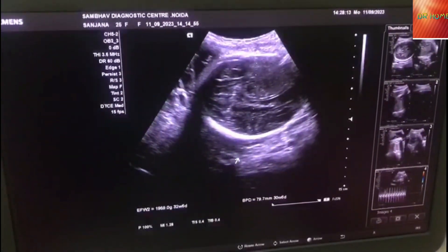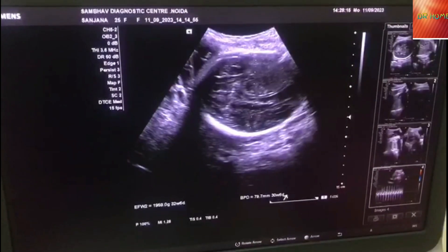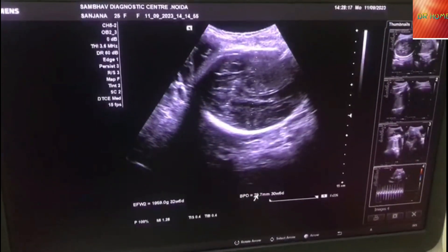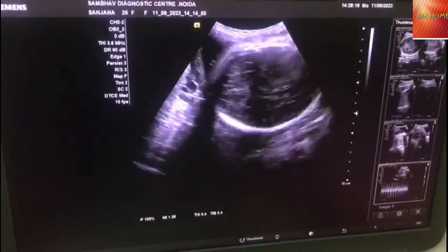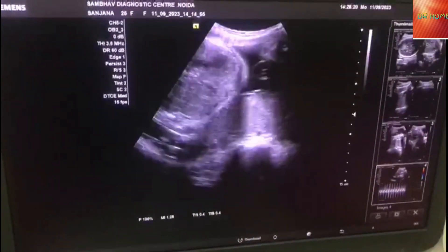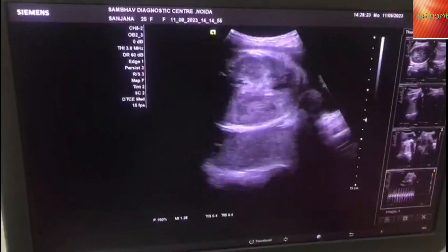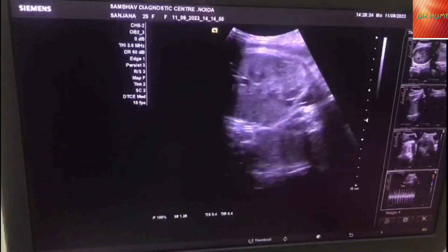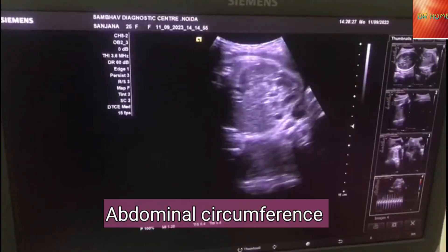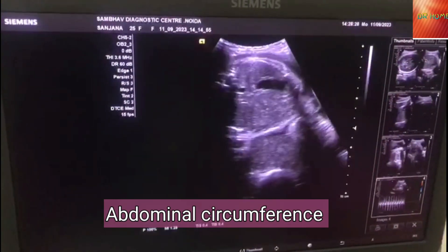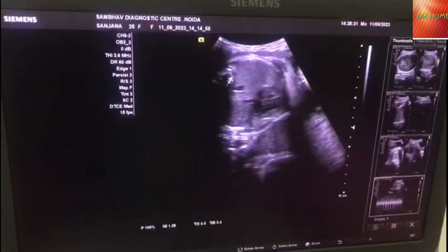This is the baby. After the child's head, we take the abdomen, which is called abdominal circumference. This is the child's tummy.